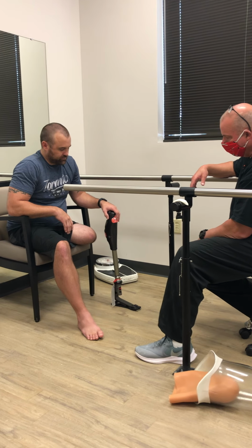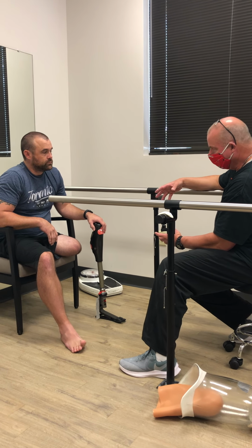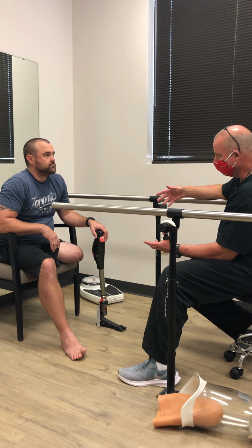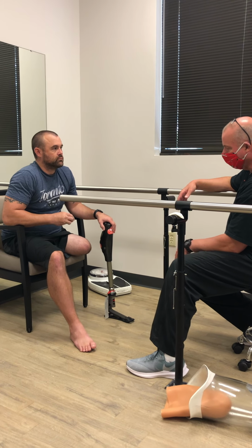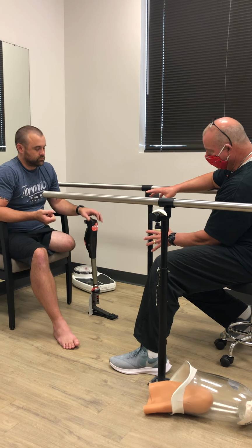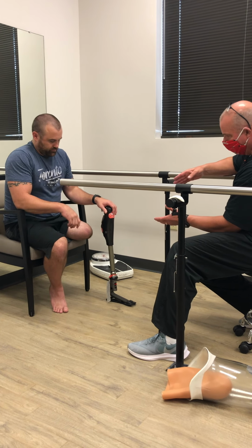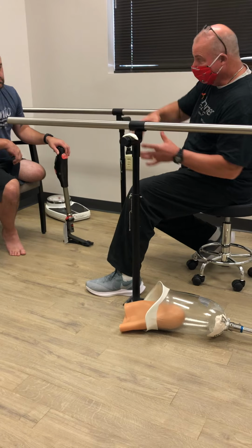A lot of these guys, I'll be totally honest, we make the initial limb for them, and they start to shrink, and they won't come back. When you start having problems, if you don't come back to the person who fixes the problems, then honestly you're just going to have problems. They'll say this thing never fit good, because they just won't come back in and see us. We're not a car manufacturer. This is a custom device, and for the most part it should work appropriately. It's technology, so might there be some snags here and there? Absolutely. The socket is an ever-changing animal. You have to think about the inconsistencies, which relate to the socket. Right now, we've got a great fit.